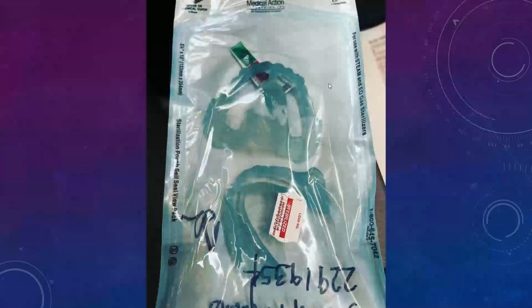Okay. And surgical guides, especially if you're printing them, well, that's one great thing about doing them printed versus doing the old acrylic way. You couldn't sterilize the acrylic ones. You could do cold disinfection, but you couldn't put it in the autoclave. With this stuff, I'm using Pac-Dent surgical guide resin, fully autoclavable with no issues. So I've been using that quite a bit, and I like it a lot.